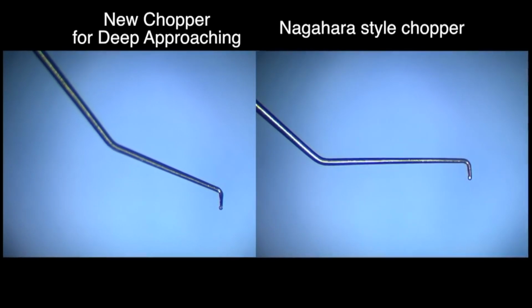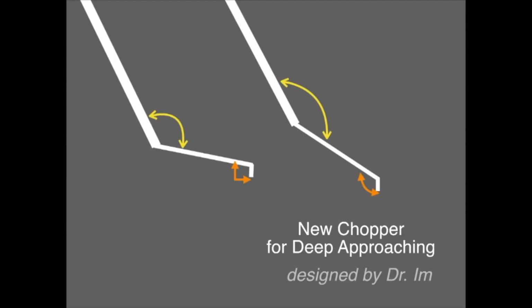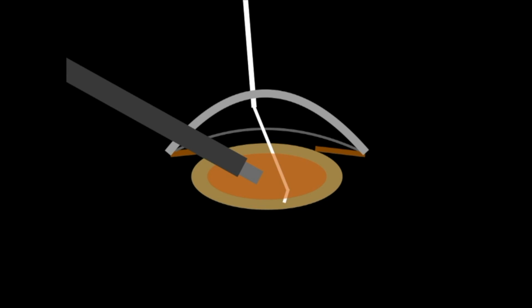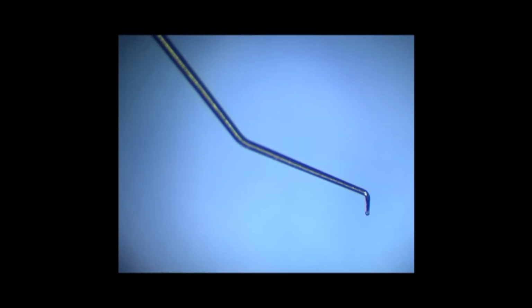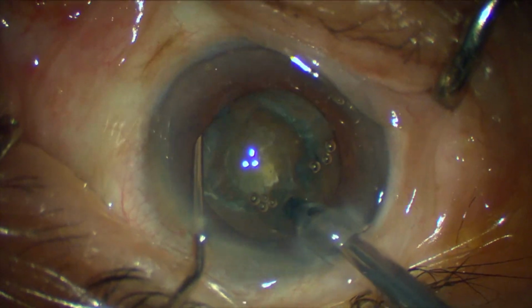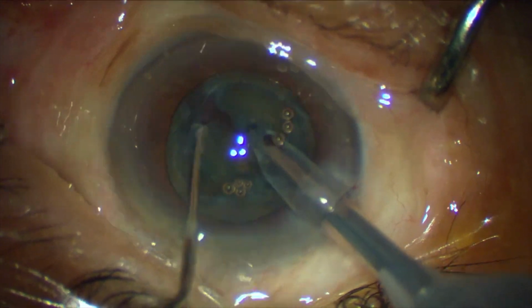This chopper has three different aspects compared to the previous Nagahara style choppers. First, the neck angle is more obtuse. Second, the tip angle is more obtuse too. These differences make it easy to approach the lens posterior with vertical orientation of the chopper tip. The obtuse angle of the tip helps keep the vertical position of the chopper even in the lens posterior.